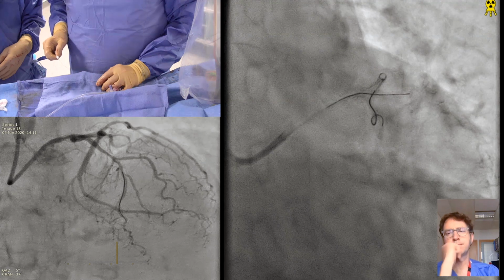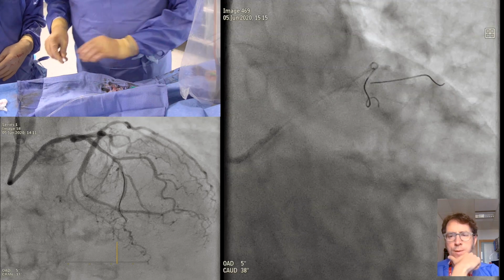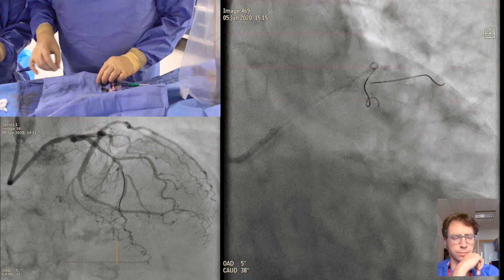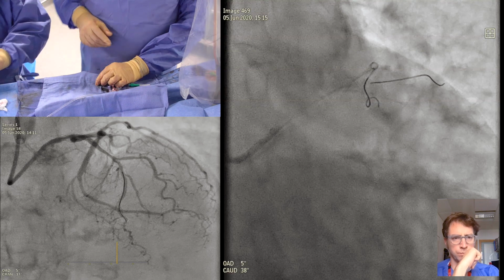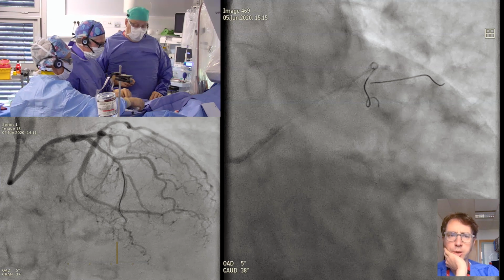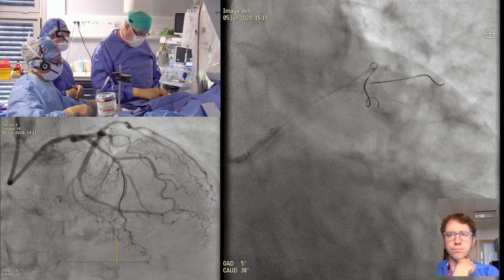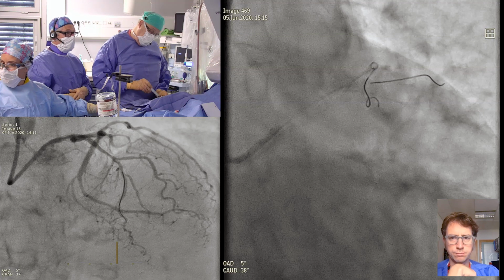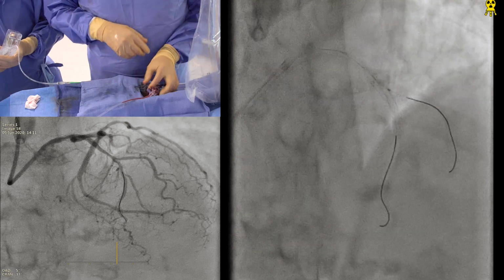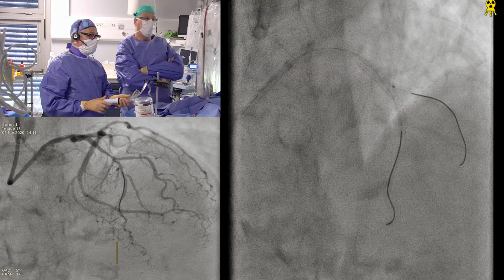Okay, this one is easier. That certainly looked easier than the previous one. Yes, this kind of wire has a lot of glide, so it's very easy. So will you go straight back to an anchor, or you try again? I think we'll try again without anchoring. Maybe we cross different struts. And we have done another POT, so you have to give us this chance. So you see probably different struts, or maybe the second POT was very useful.